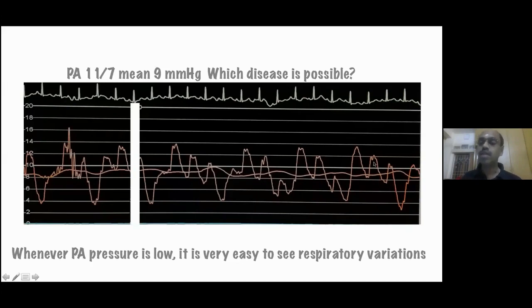Does every unilateral pulmonary stenosis need a CT, MRI or perfusion study? In order to find out the significance of hypoperfusion of one of the sides, it is important to do an MRI or a perfusion study. This is a functional study. CT or angiography is an anatomical study. An anatomical study will tell what is the severity of luminal narrowing. A functional study will tell the ratio of perfusion between the right and the left side.